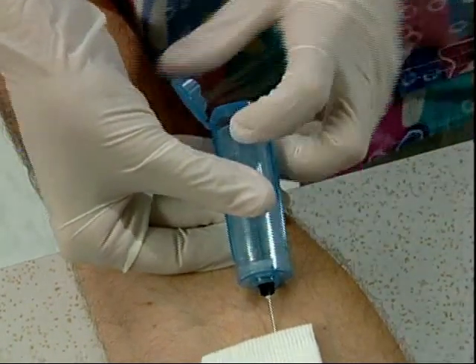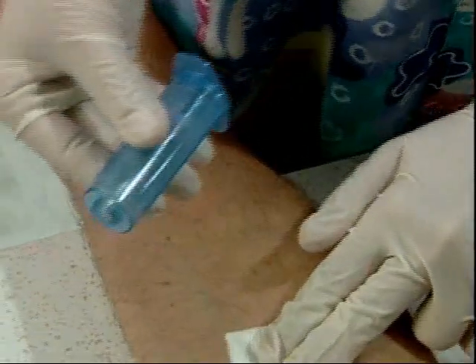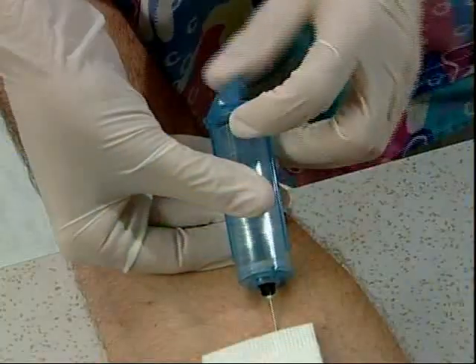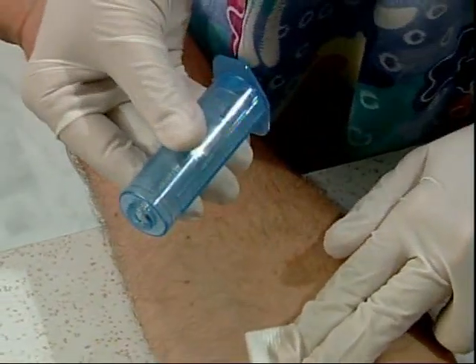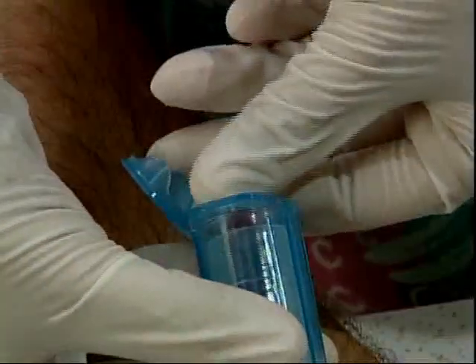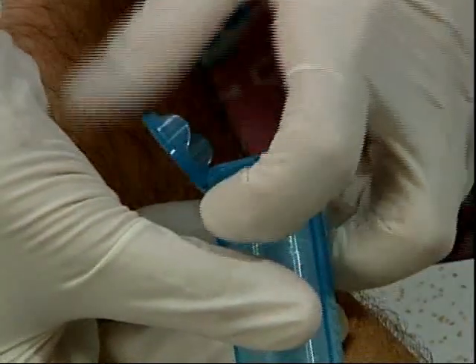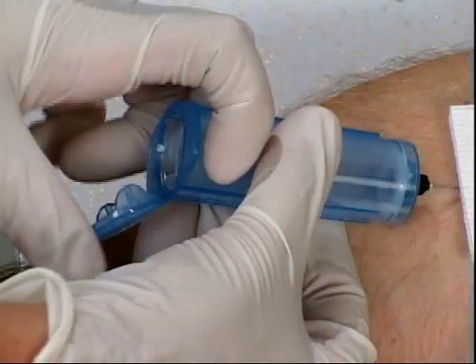VanishPoint allows you to keep both hands safely behind the needle while activating the retraction mechanism. The needle will automatically retract directly from the patient into the tube holder, protecting you from both ends of the blood-filled needle. By placing your fingers behind the tube holder flanges and your thumb on the end cap, the end cap can be quickly and easily closed.